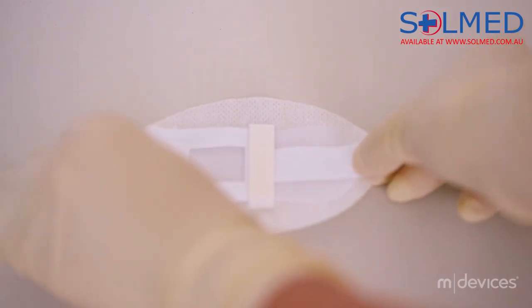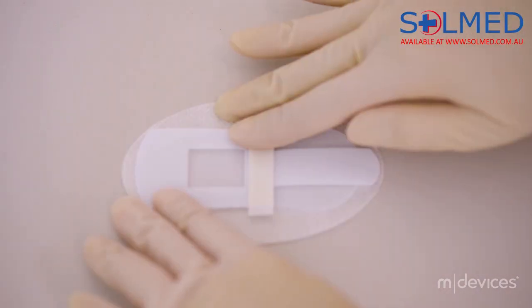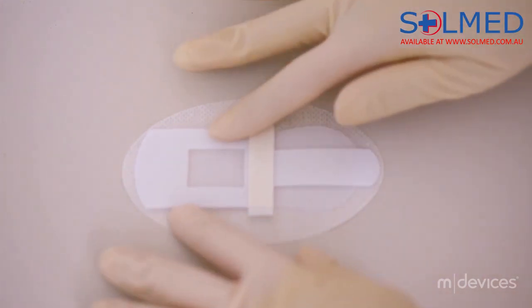Step 4: Apply the universal securement device to the desired location without any wrinkling on the dressing.